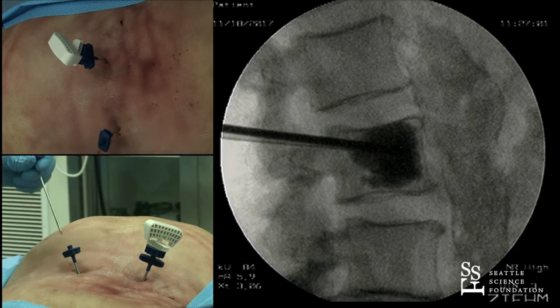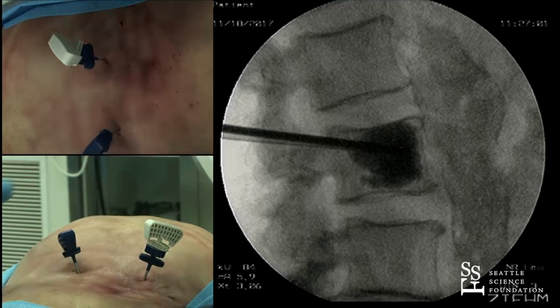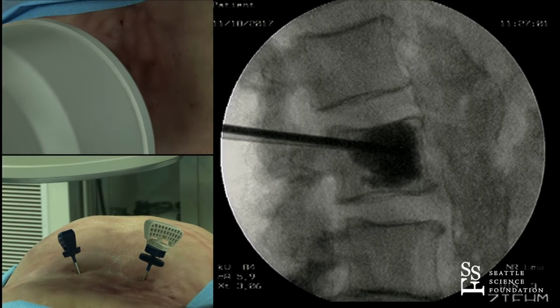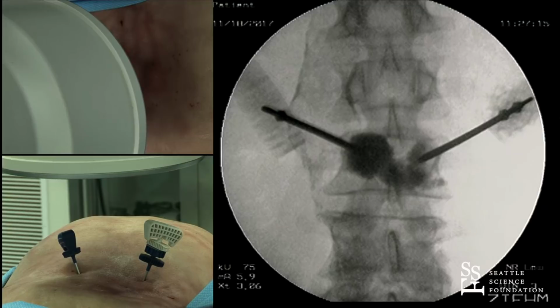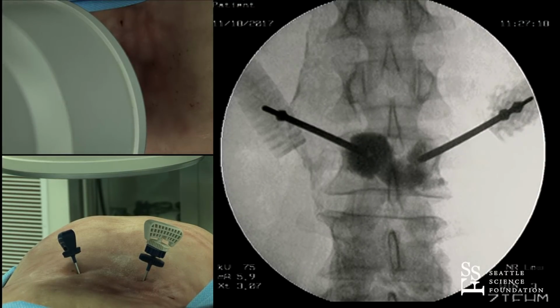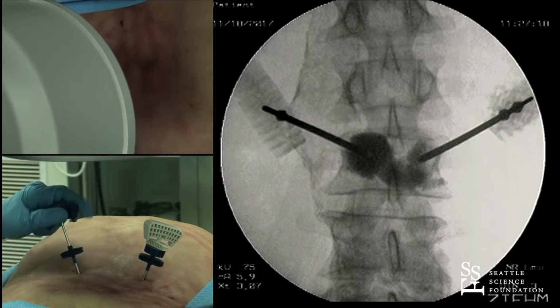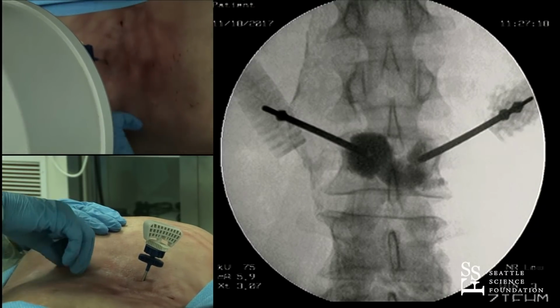And so, final step here, and this is critically important, make sure you fill the cannulas with the stylet. Place the stylet back in before you remove. And so now I'm satisfied. And Doug, you're doing that because you don't want the cement to back up the cannula? Exactly. So we put the stylet back in, we tap it down, and you make sure when you tap it down that there's no cement backing up.